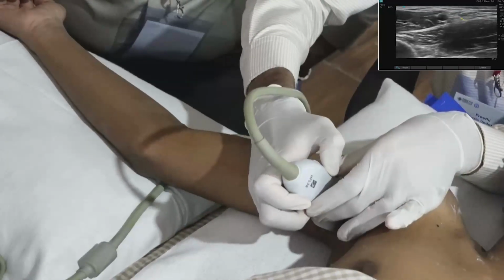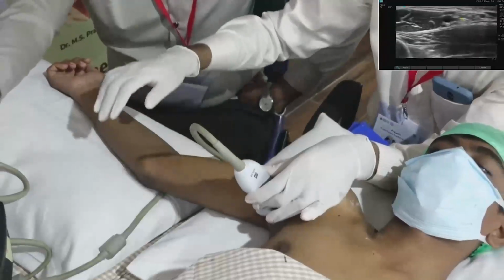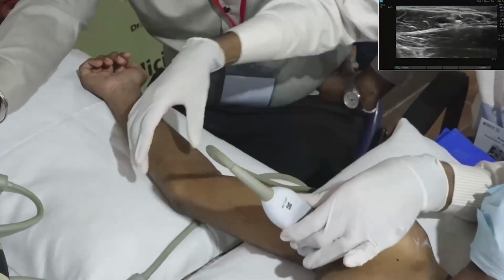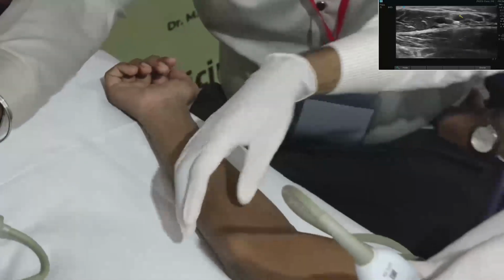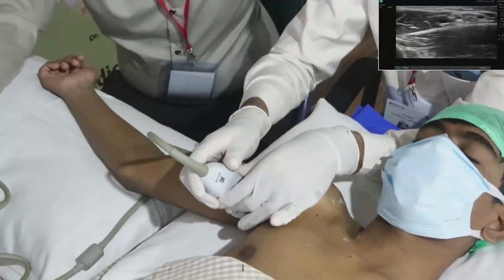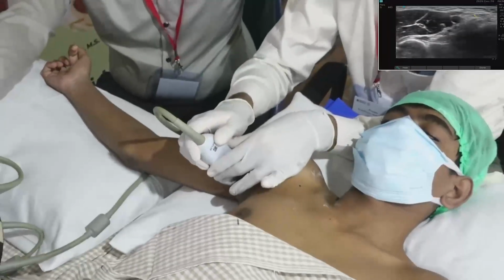So the other way of scanning the medial cutaneous nerve, another important component of the brachial plexus itself: the lateral aspect of the forearm is supplied by a branch of the musculocutaneous nerve, the posterior aspect by the radial nerve, and the medial aspect is a direct branch of the brachial plexus, a cutaneous nerve. It is difficult to trace, but it usually lies next to the ulnar nerve. We know where the ulnar nerve is.